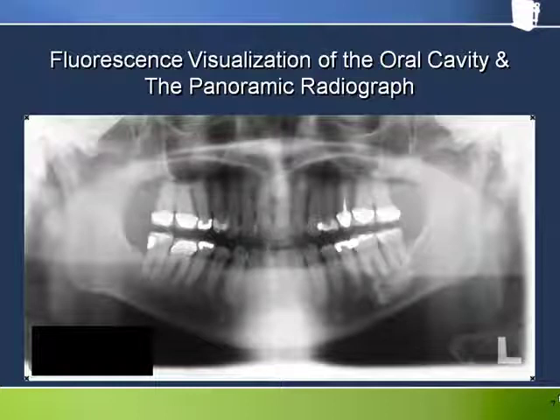While radiography provides indirect visual images of human tissue that is displayed either on a computer monitor or on radiographic film, VELscope uses direct, real-time visualization of the tissue. Similar to radiographic interpretation and imaging, VELscope utilization requires an understanding of underlying principles, a sound background in anatomy and physiology, and an appreciation of normal variance. This understanding is a key to taking full advantage of the technology and using it to discover abnormalities that truly warrant further investigation.